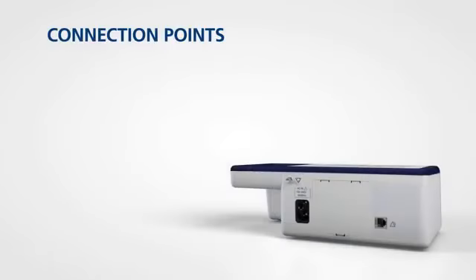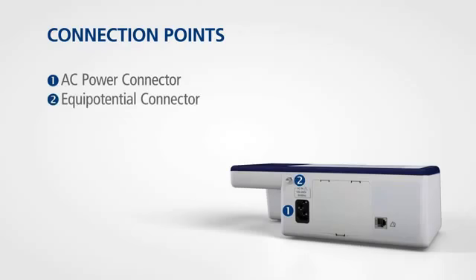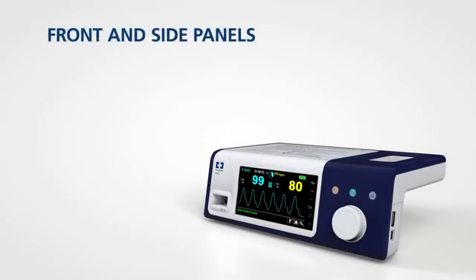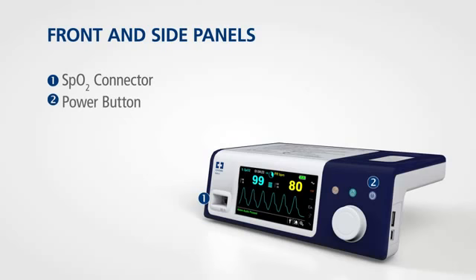On the back of the monitor, you'll find connections for AC power, an equipotential connector, and a nurse call port. The rear panel also offers access to the monitor's battery. The front panel provides the connection to the SpO2 sensor. The power button is on the top right of the panel. Just press and hold the button to turn the monitor on or off.